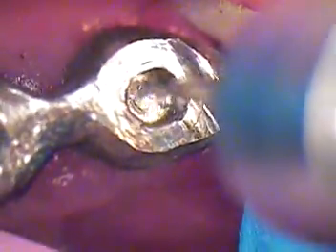Very comfortable in just this approach. So we're going to just use this approach here for now. I need a periodontal probe next. So we're going to measure this height and compare it to what we have. So this is almost 2 millimeters in height.